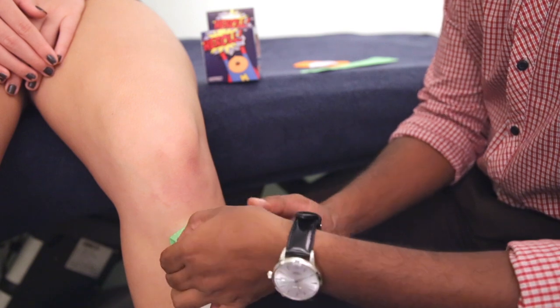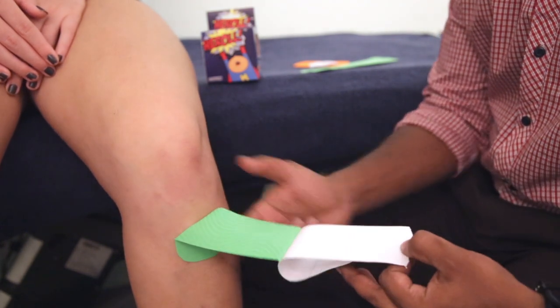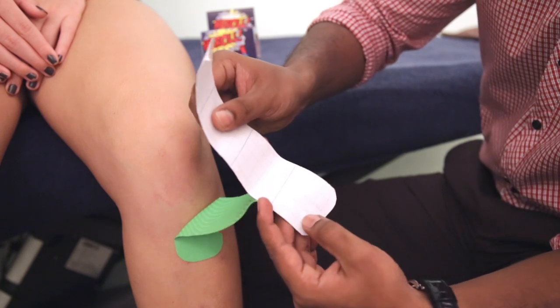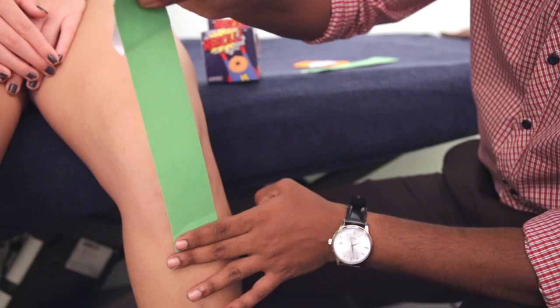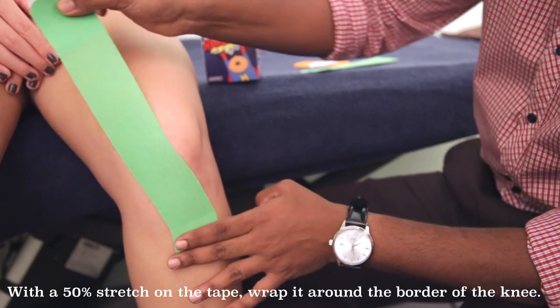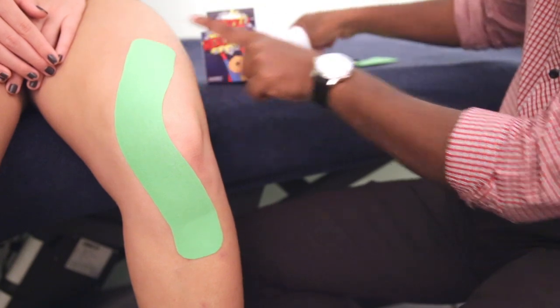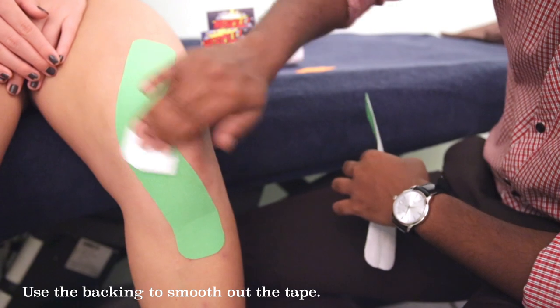You are going to pull away the rest of the tape while holding on to the anchor. We will be leaving out just one box. Pull it to 100%, come back to about 50%, and you are going to go around the border of your kneecap and all the way up. Place this down, and you are going to just relax on the anchor at the top. We will be rubbing it down as well.